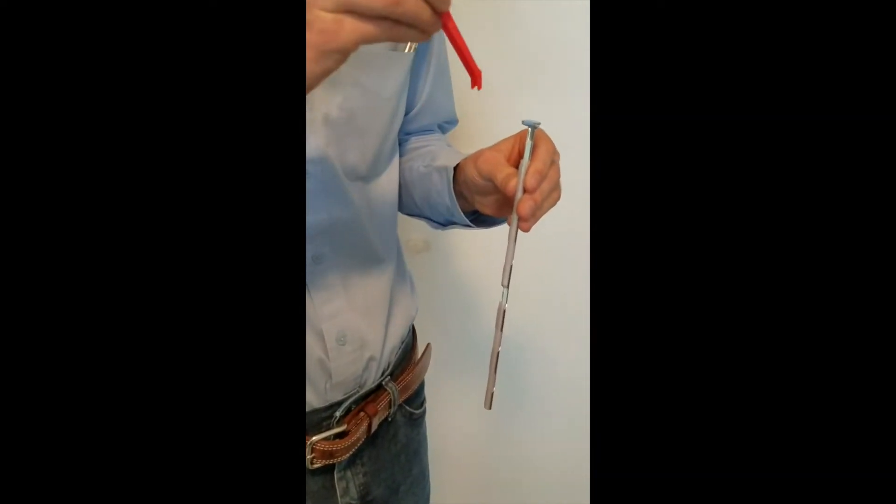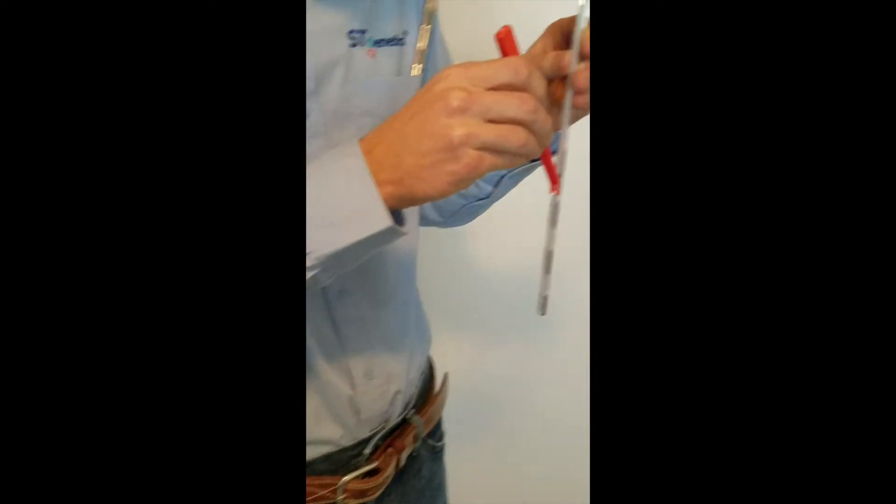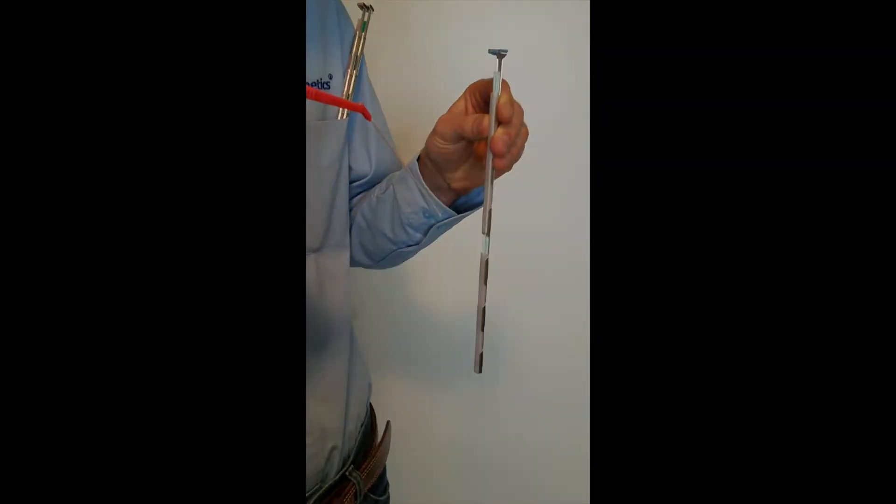When you're using any quarter cc semen, we recommend you use these quarter cc tweezers. If you hold it at this sort of an angle, you can get the tweezers down inside the tank without exposing too much of the semen.